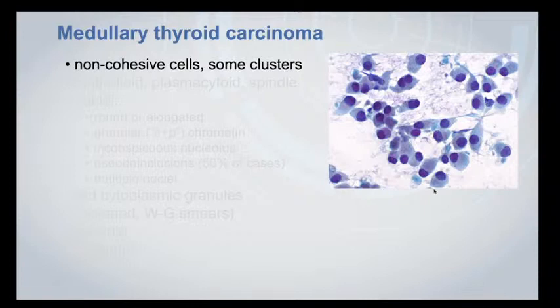So sadly, we have to wave goodbye now to papillary thyroid carcinoma and talk about some other malignancies that we will see on thyroid FNA. And the next one I want to talk about is medullary thyroid carcinoma.